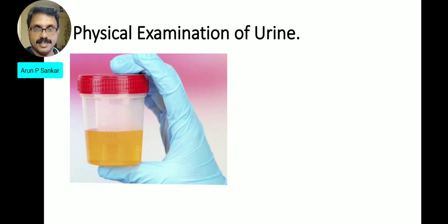What is the physical examination of urine? We are doing the physical examination in the lab using a proper and complete method.